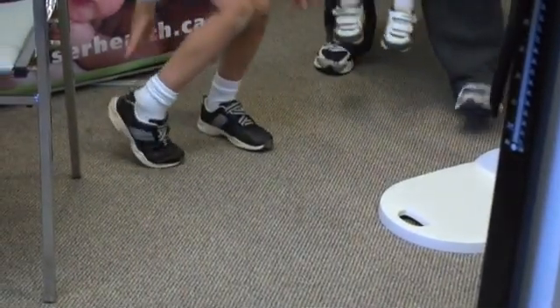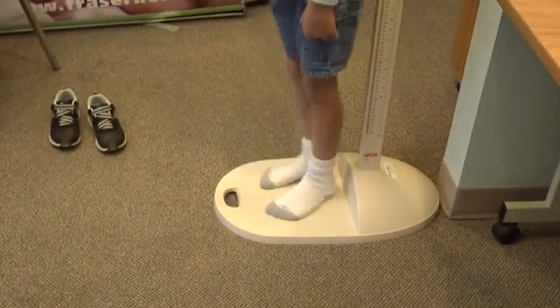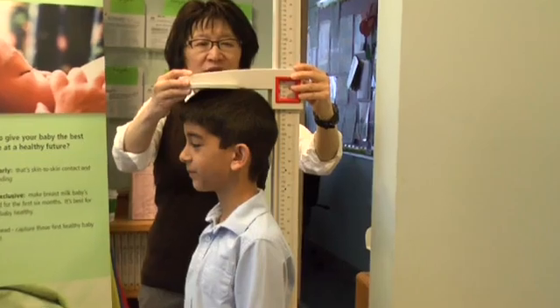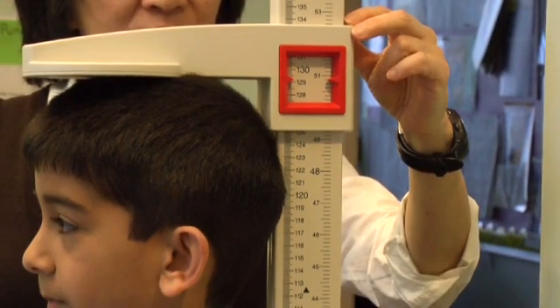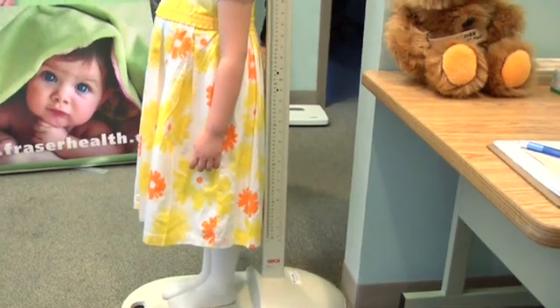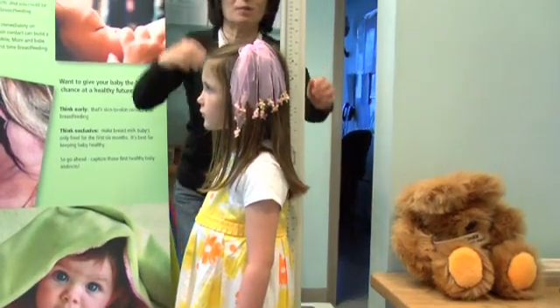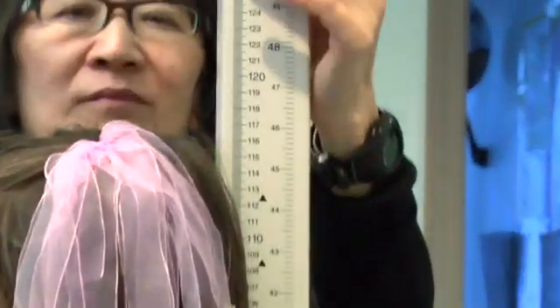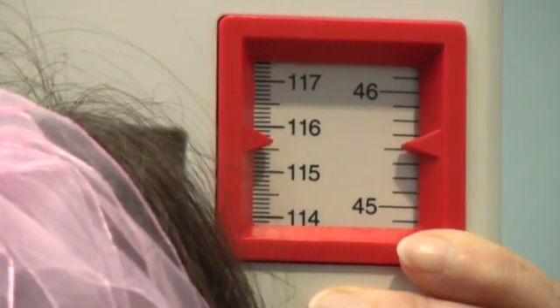Measure height for children over 24 months who can stand unassisted. A stadiometer for height measurements requires a wall-mounted vertical board with an attached metric rule, or a portable stadiometer secured to the wall with a broad sturdy base, and a horizontal headpiece that can be brought into contact with the superior part of the head. A stature device affixed to a weight scale does not provide an accurate measurement. The child or adolescent stands against the stadiometer without shoes, with heels together, legs straight, arms at side, and shoulders relaxed. Position the child's head so that the eyes are directed straight ahead. Bring the measuring arm down so that it rests firmly on the crown of the child's head and read the measurement to the nearest 0.1cm.